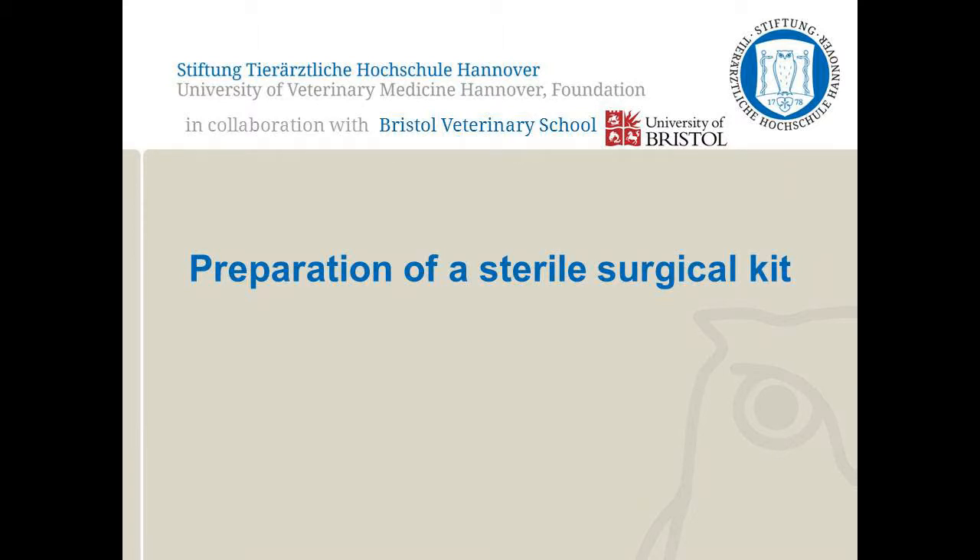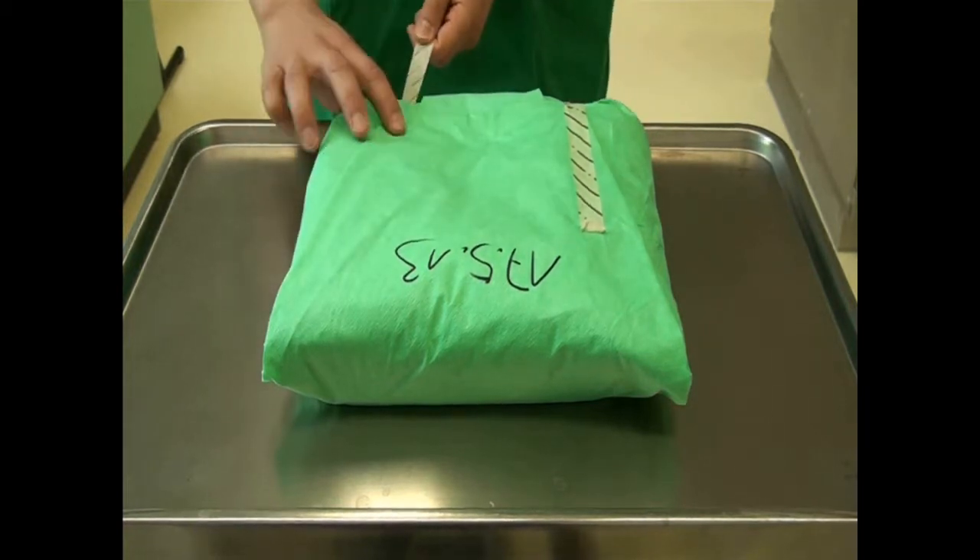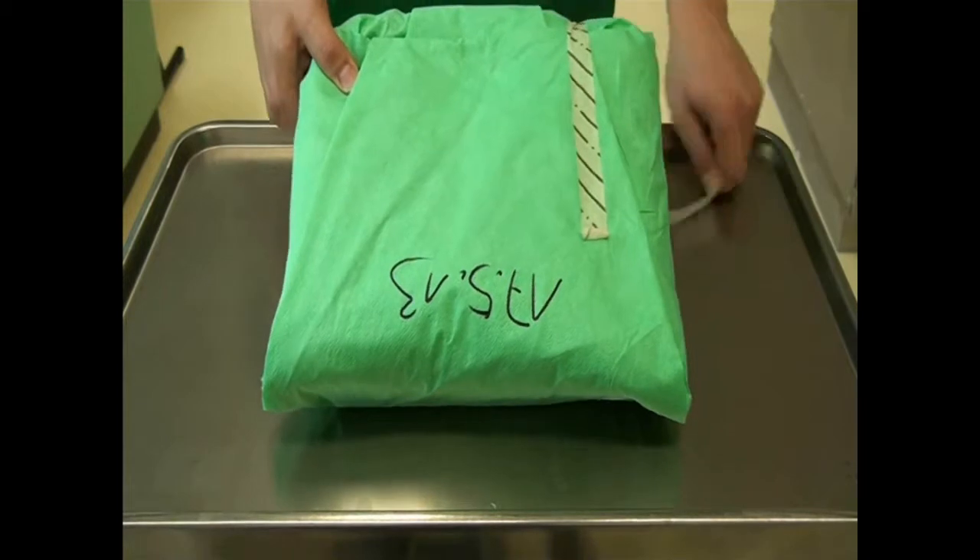In this video, how to prepare surgical instruments ready for surgery is demonstrated. The surgical instruments are in a sterile pack. Check the date on the pack to ensure it is still sterile.